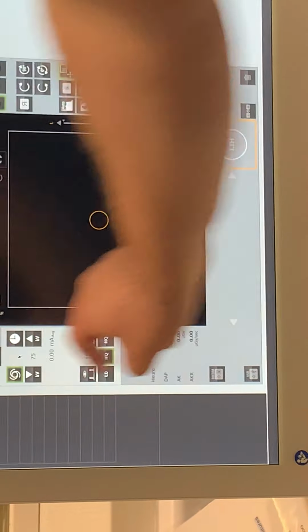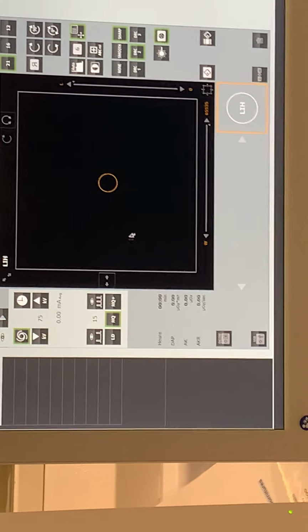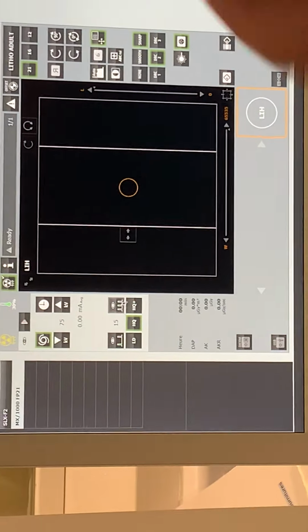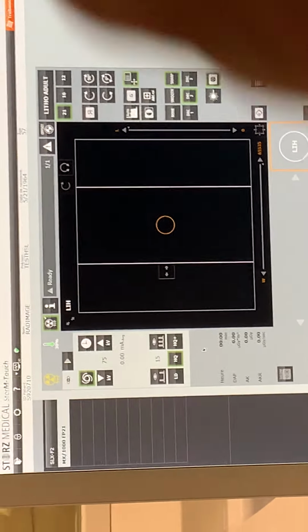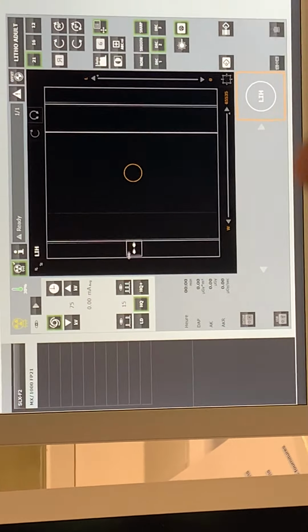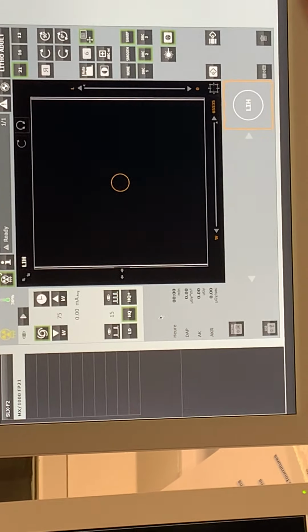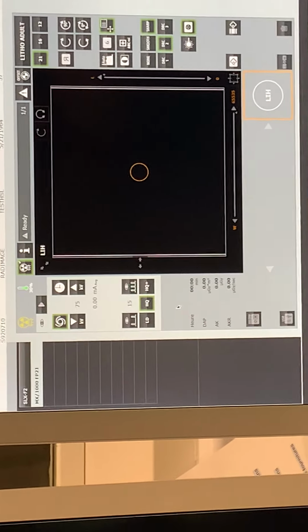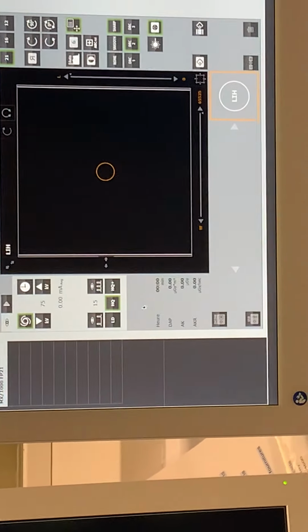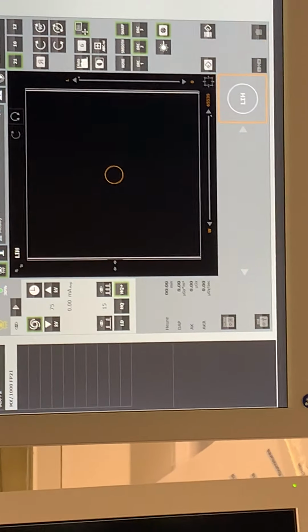Here is automatic brightness control for the fluoroscopy, which means please don't change it, because if you change it, you need to adjust the kV on your own. And you have the pulses. As we are working in lithotripsy, we want to see the stone moving. That's why it definitely makes sense to stay at 15 frames per second, meaning 15 images per second, to see a smooth picture where the stone is moving. As well, if you have a very big patient, and our maximum kV is 120, and you still do not have a good image, you can go to HQ Plus to get a better image.